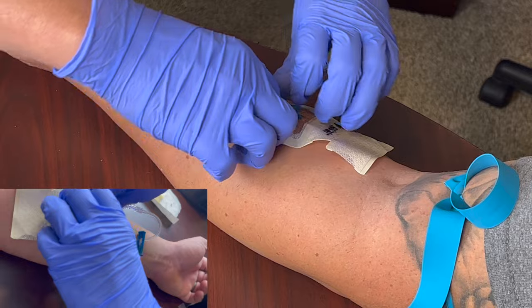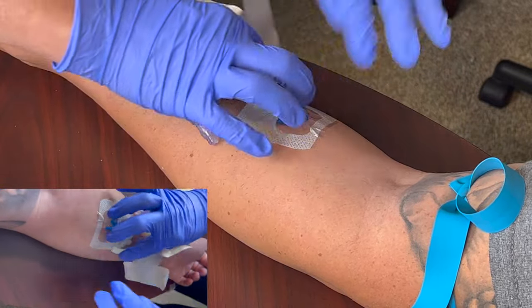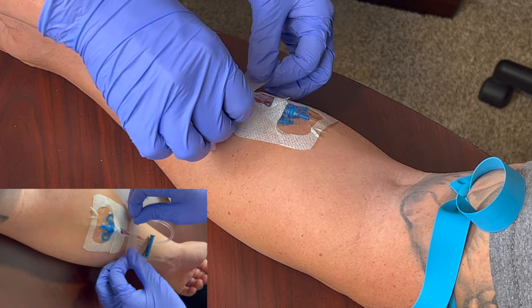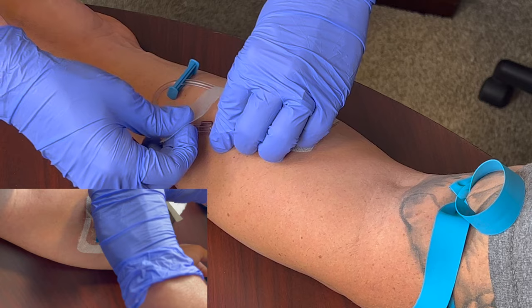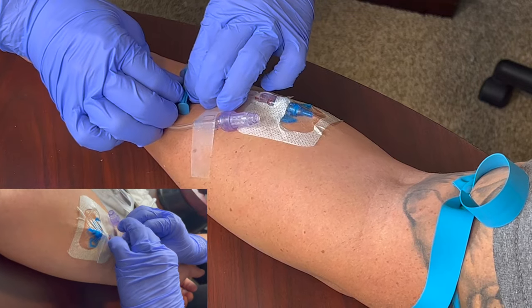Now she's applying a Tegaderm dressing and securing the J-loop connector to keep it from pulling or tugging, and covering up the hub at the end as well. Just like that — new money. She's got us fixed up with a beautiful IV.